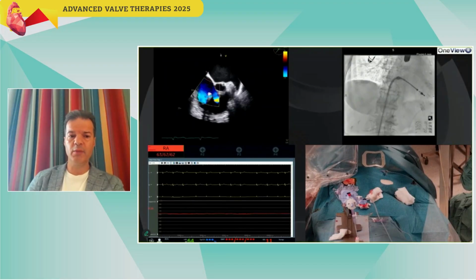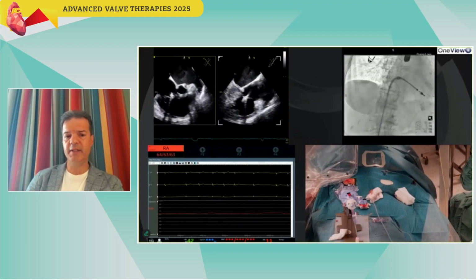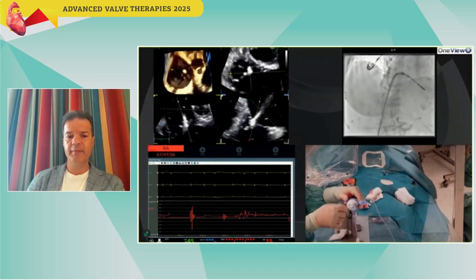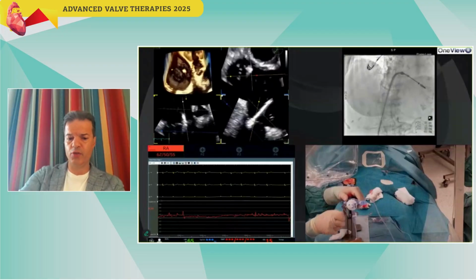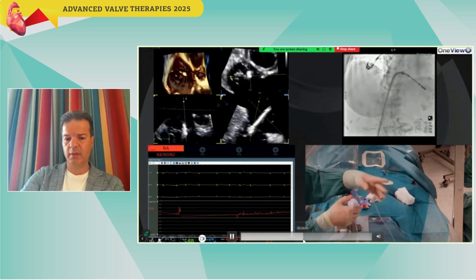And now you can see we've already had some reduction on the tricuspid regurgitation. Most of the anterior jet has gone. And we always check, of course, the leaflet insertion. We do all the regular checks, make sure we're happy, recording the grasping and reviewing. And you can see, and this is now a release of the clip. I'm just going to run it a little bit faster, all the steps. Yeah, good idea.